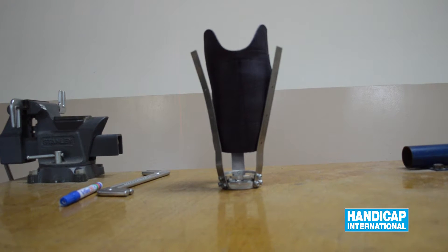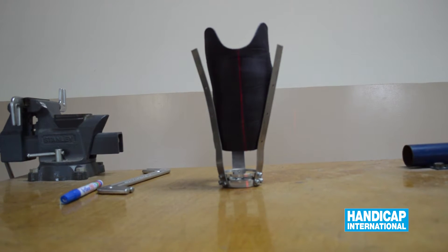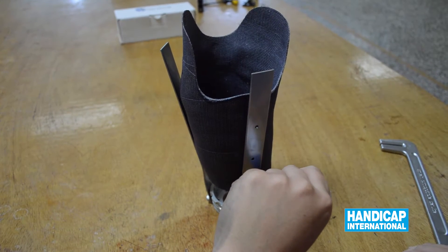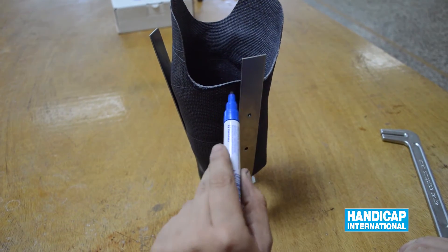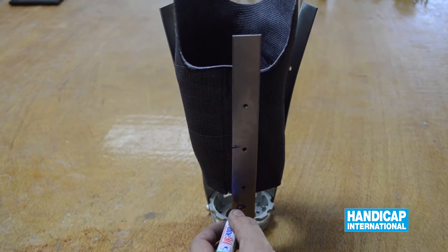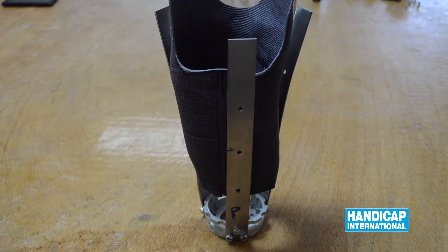Verify the frontal alignment. Mark the reference lines of the alignment. Do not forget to mark the base of the prosthesis to ensure the right position of the sidebars.